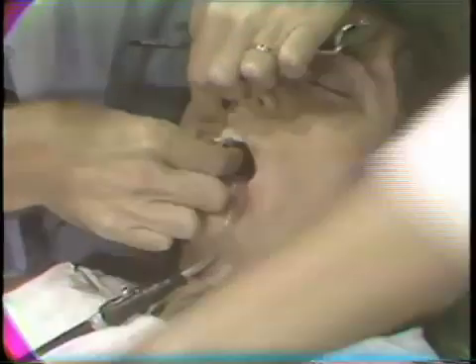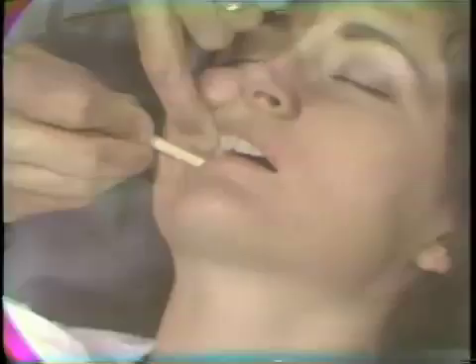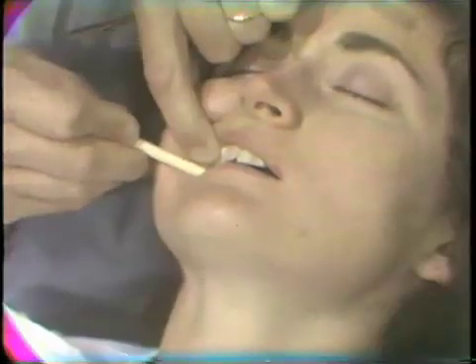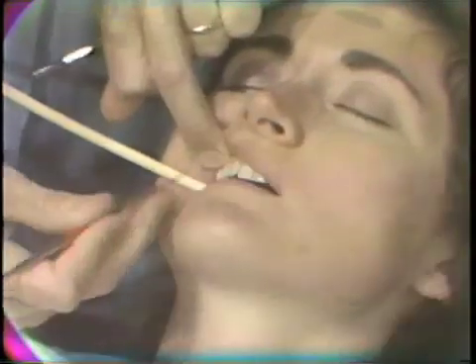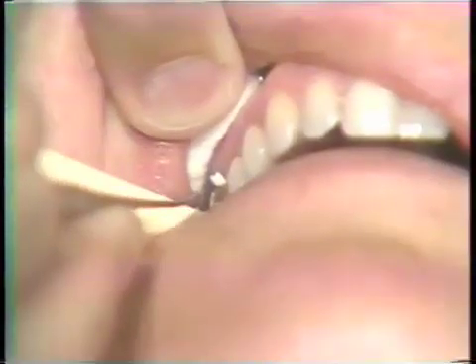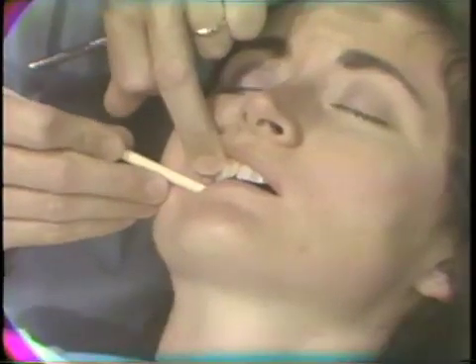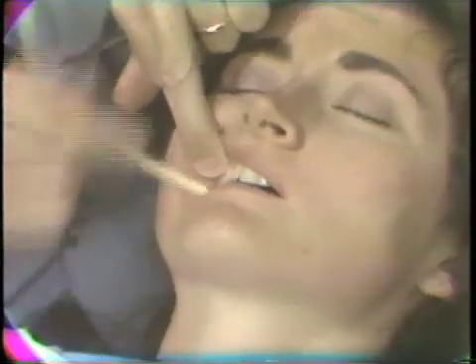The casting is now inserted, seated first with finger pressure, and then with the orange wood stick. An explorer is used to confirm the marginal seating. The casting is determined to be seated. Squeezing again firmly with some vibration applied to help seat the casting fully.